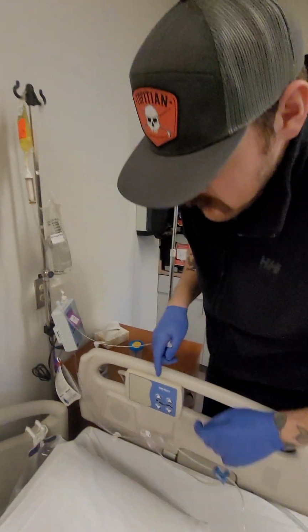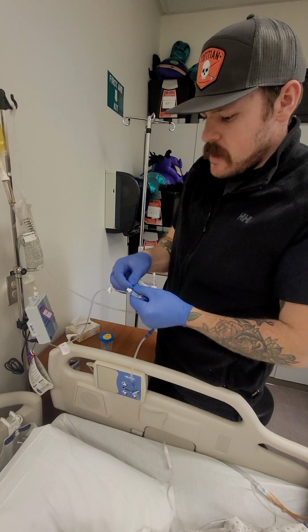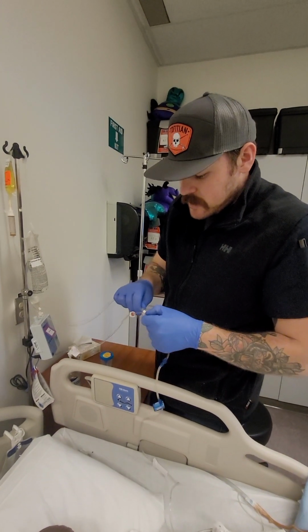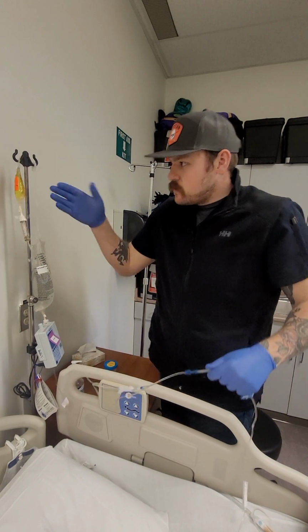Next, we can grab another swab, making sure not to touch that. Wipe this for 15 to 30 seconds. Let it dry for 15 to 30 seconds. We can attach this here. So everything's closed right now. What I want to do is I just want to backfill this line.